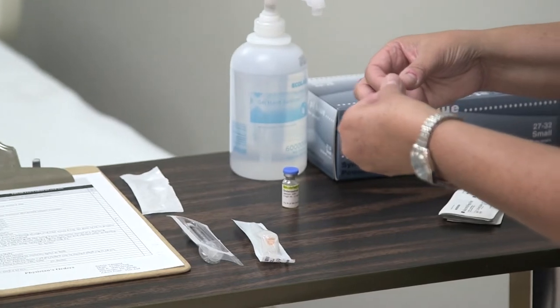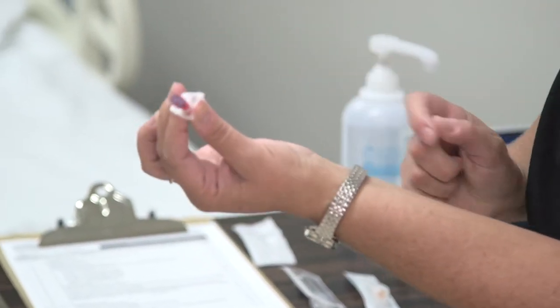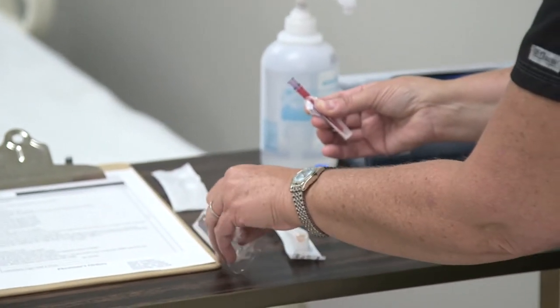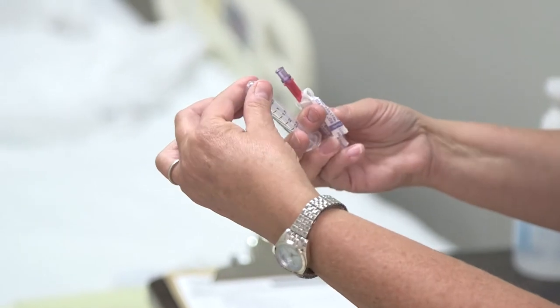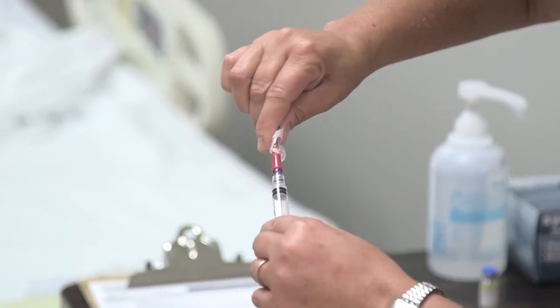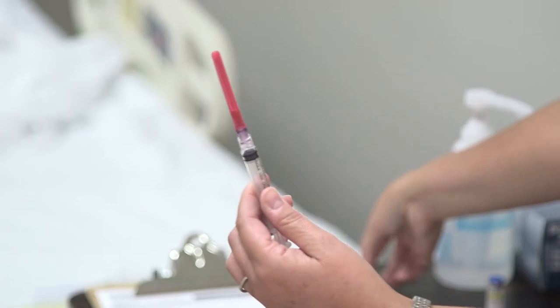So what we can do then is open this one up, making sure you're keeping the opening of the blunt needle sterile. And then you're going to grab your 3 ml syringe, which is appropriate because I'm going to be giving 2 ml. This one has a cap on it, so you can remove the cap and just get rid of it. And then you can go ahead and screw on your blunt filler needle.